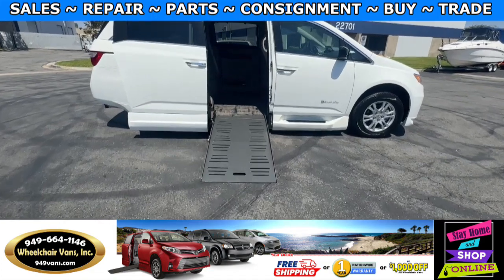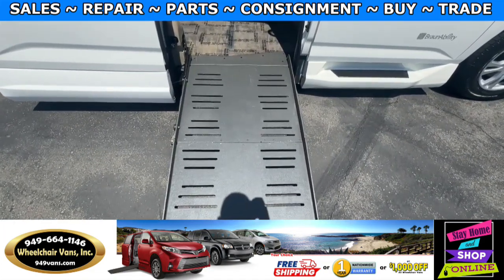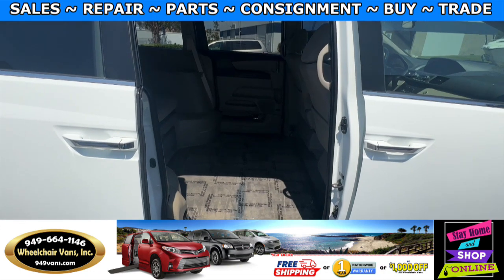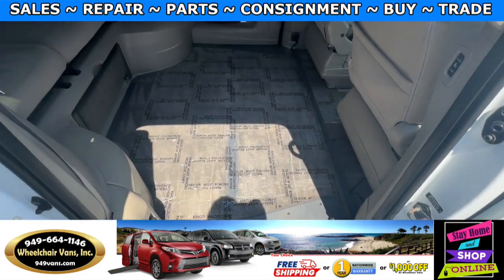Let's head inside and check out the setup. This is the foldout ramp and the width on this ramp is going to be 28 inches. Entrance height from the floor to the top of the door is going to be 54 inches. In the middle you will have the wheelchair user.